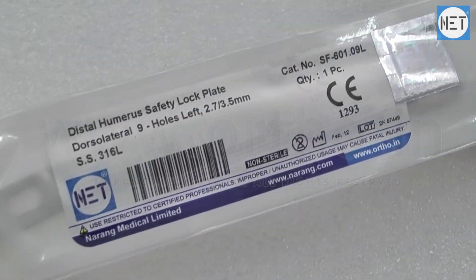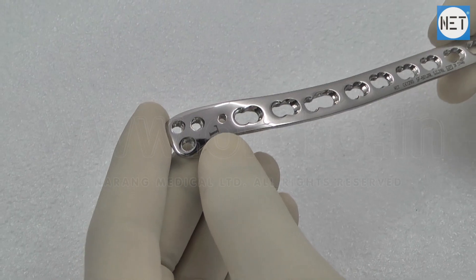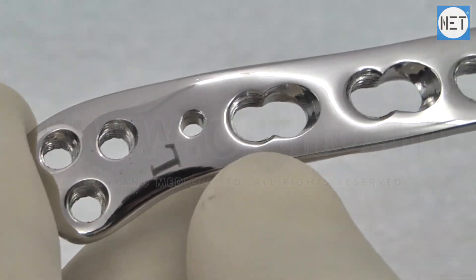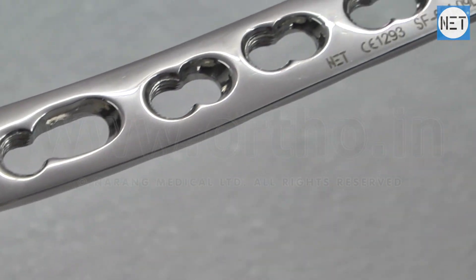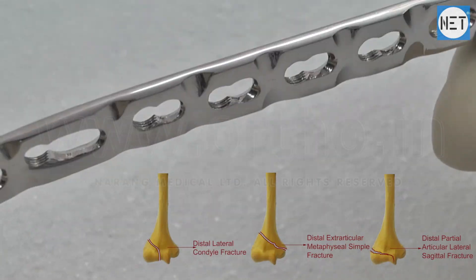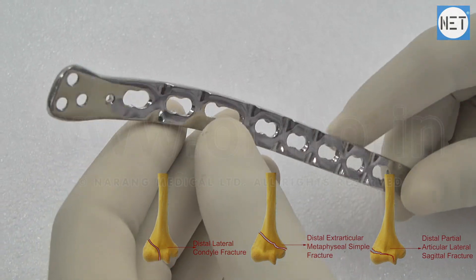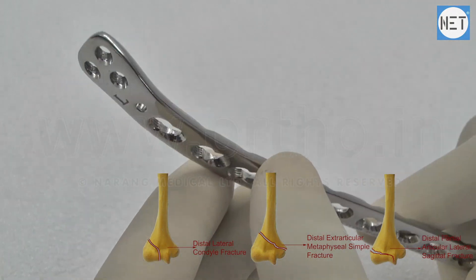Net Brand Distal Humerus Safety Lock Plate 2.7-3.5mm Dorso-Lateral. These safety lock plates are primarily used for fixation of fractures of distal, lateral condyle, distal extra-articular metaphysical simple, and distal partial-articular lateral sagittal fractures of humerus.